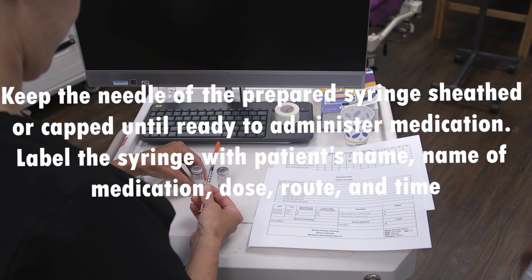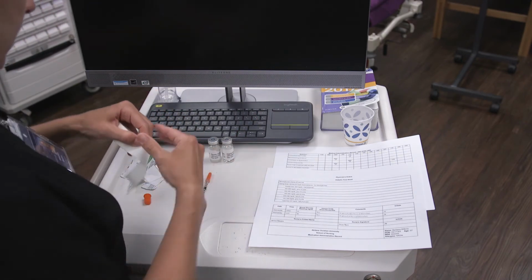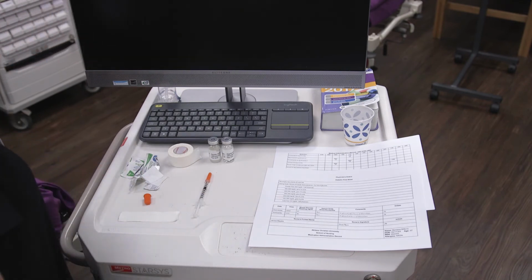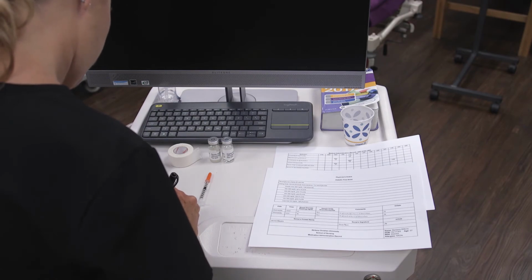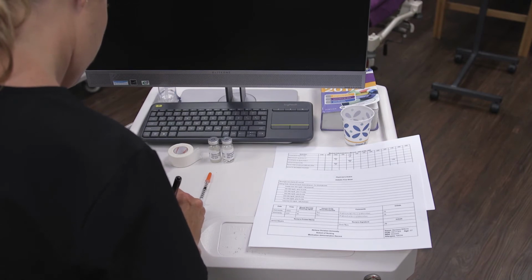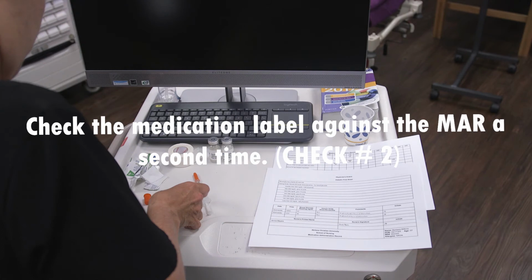Label the syringe with patient's name, name of medication, dose, route, and time. Check the medication label against the MAR a second time.